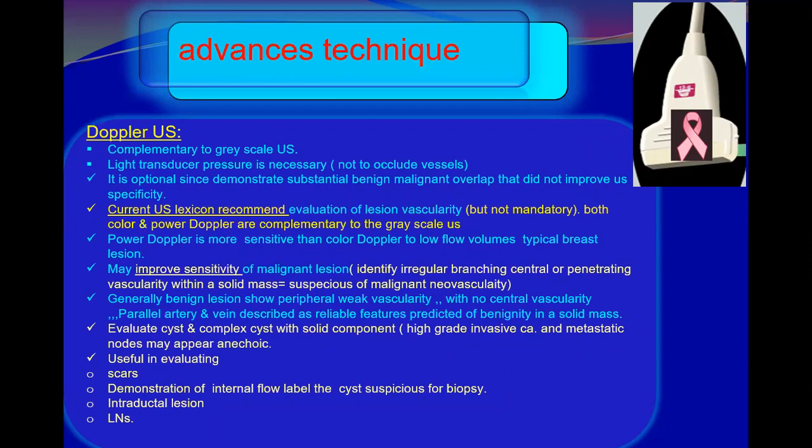Also inside the ducts, the same concept. If we have intraductal lesions, excellent, well done. Helpful in intraductal lesions. What else? Helpful in the axillary lymph node. Excellent, well done. Okay. What else? Mastitis and inflammatory processes in the breast.